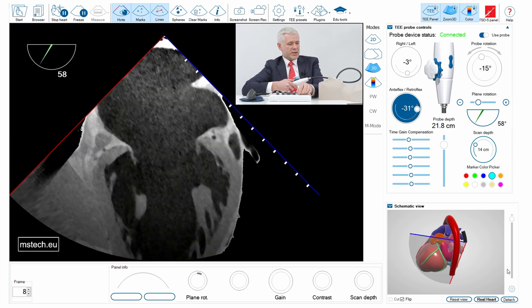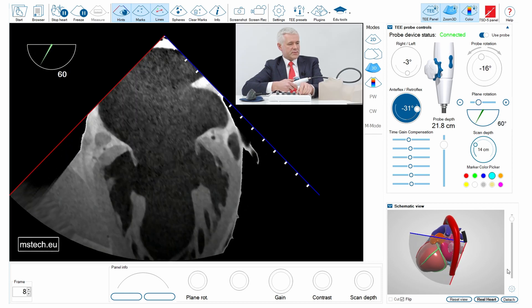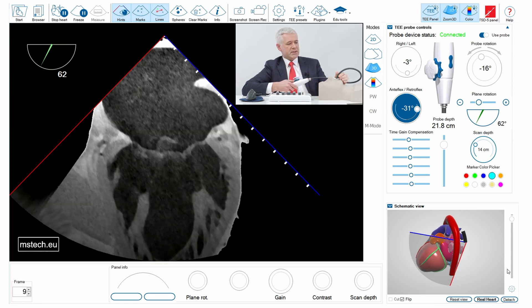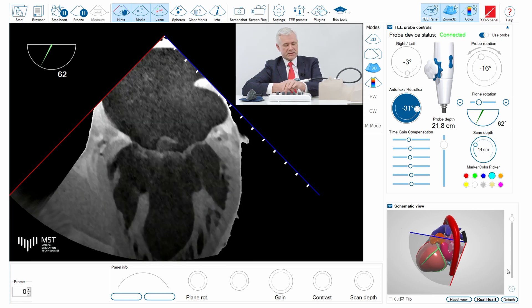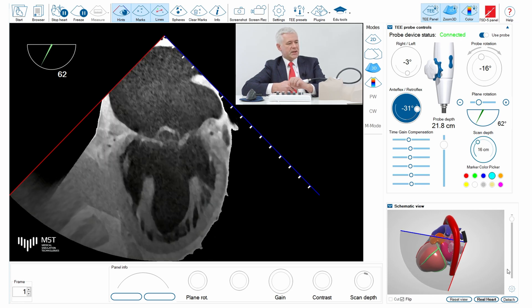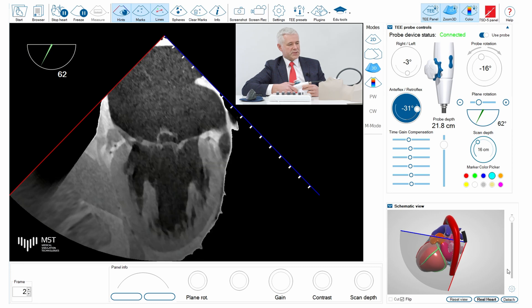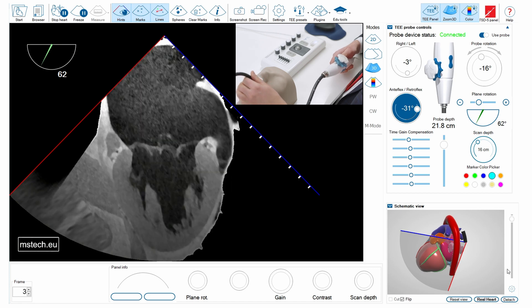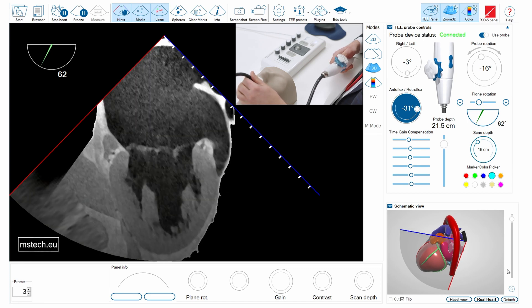I change the scan angle to approximately 60 degrees. Here you can appreciate the papillary muscles deep in the left ventricle, good contractility, and also the prolapse of most probably the P2 segment of the mitral valve.